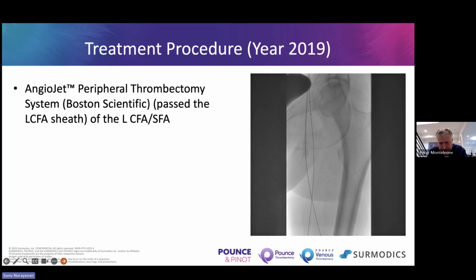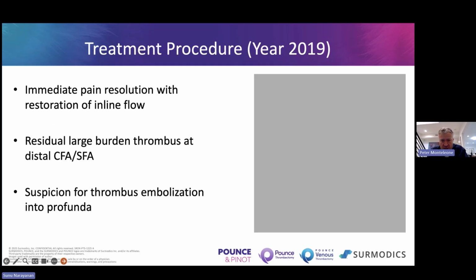Next slide. And so we used the tools we were using. We kept angiojetting. We kept trying the mechanical thrombectomy, the aspiration thrombectomy tools that we had, pushing down beyond our contralateral sheath. You can see the angiojet device there going to try and infuse some TPA with the Duell, at least to try to get rid of the acute pain. Let's go to the next slide.